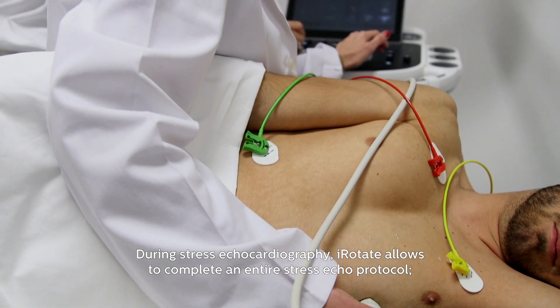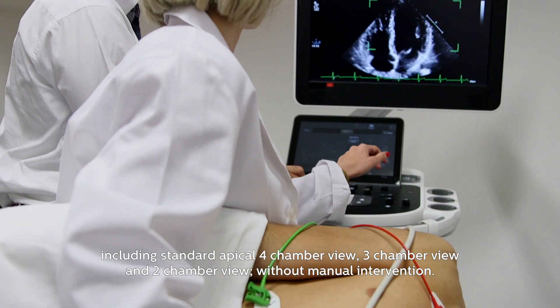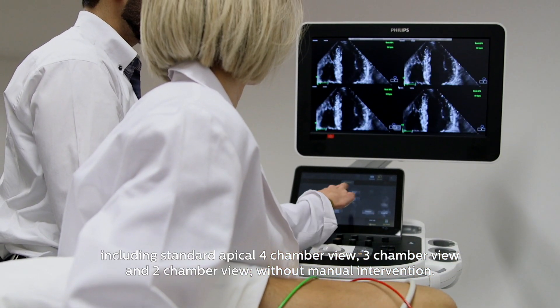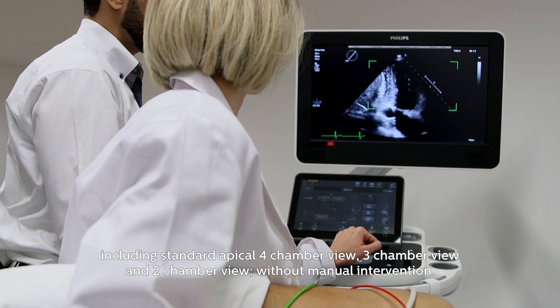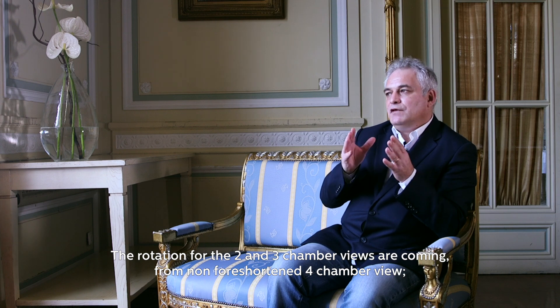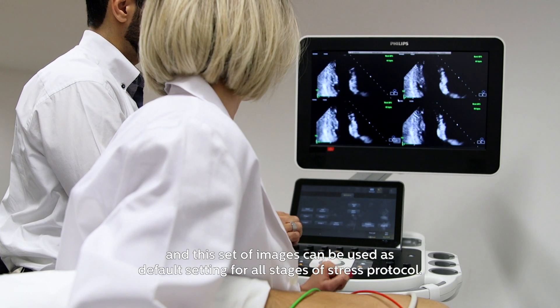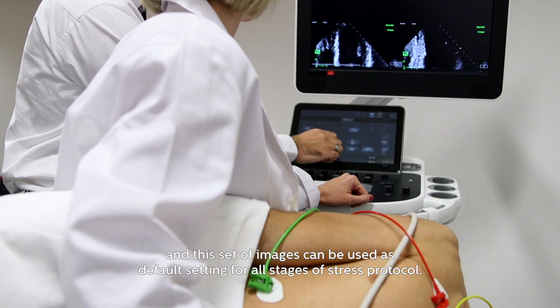During stress echocardiography, I-Rotate allows to complete an entire stress echo protocol, including standard apical four-chamber view, three-chamber view, and two-chamber view, without manual intervention. The rotation for two- and three-chamber views comes from the non-foreshortened four-chamber view, and this set of images can be used as default settings for all stages of the stress protocol.